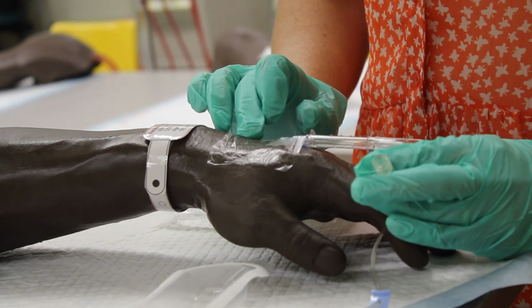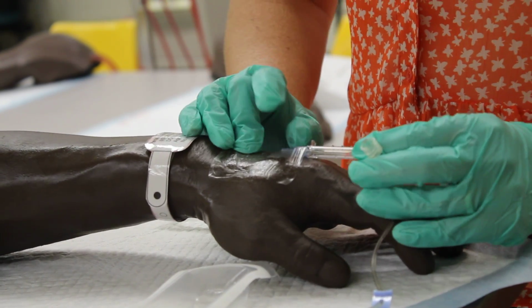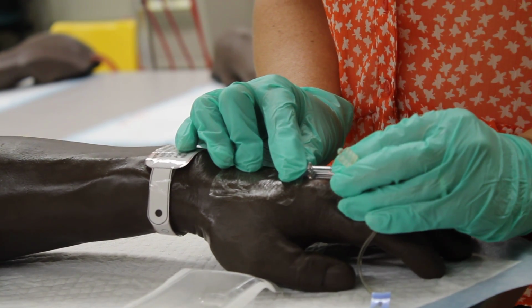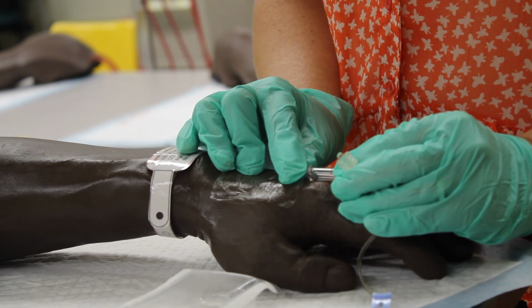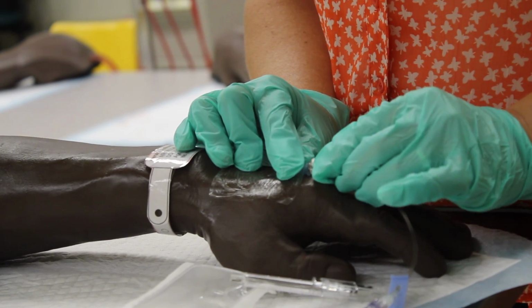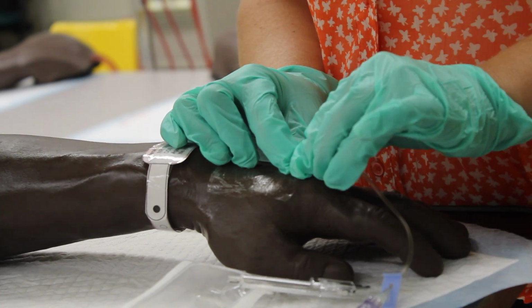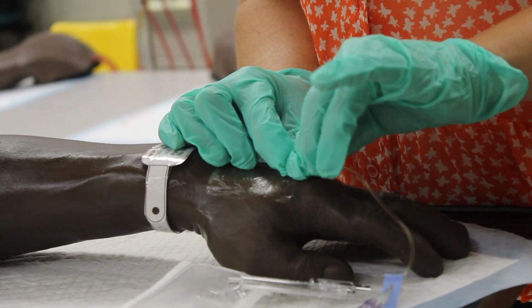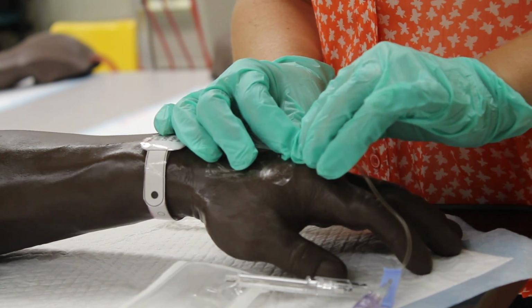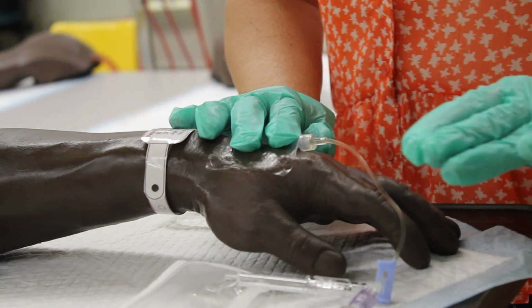Estimate where the end of my plastic cath line is. I want to apply pressure at that point to try to stop some of the bleeding. Hold pressure and stabilize my catheter at the blue hub. I can touch it now because it's covered by the Tegaderm. Take that, I remove the needle, insert the extension set, and then make sure that it is screwed on there tightly so that it does not come apart while you're stabilizing this on your patient. And remember, that could be painful for them, so you want to try not to move it too much.